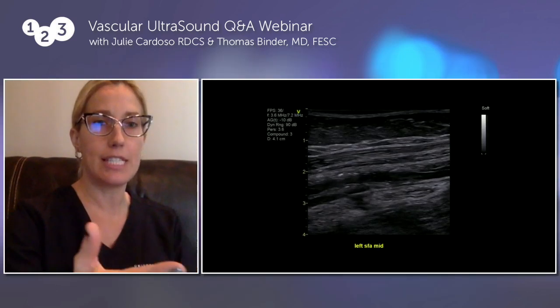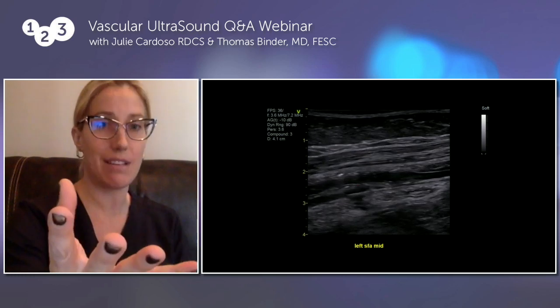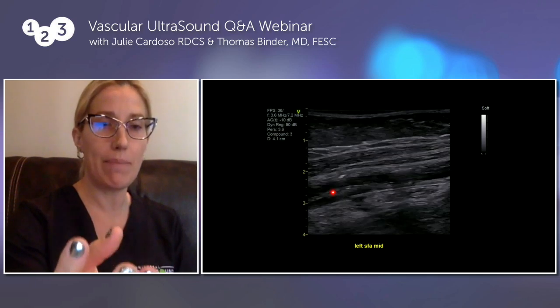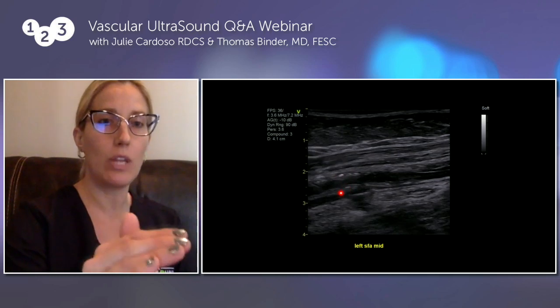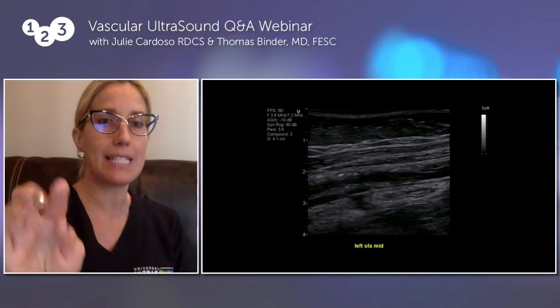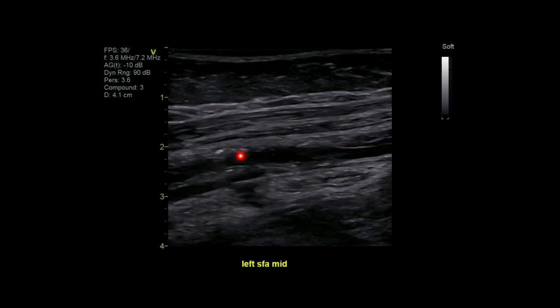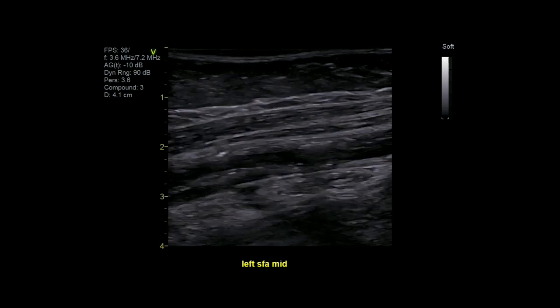Calcified, as you can see in this vessel here in B mode, there are different plaque characteristics, brightness of the plaque within the lumen. So this would be heterogeneous with mixed calcification. The bright white part would be calcified, and the low-level grayness of the echoes within this lumen would be hetero. Also, you can see that it's irregular in shape. It's not consistent and smooth along the anterior and the posterior wall of the lumen. So this would be categorized as irregular, hetero slash calcified plaque.